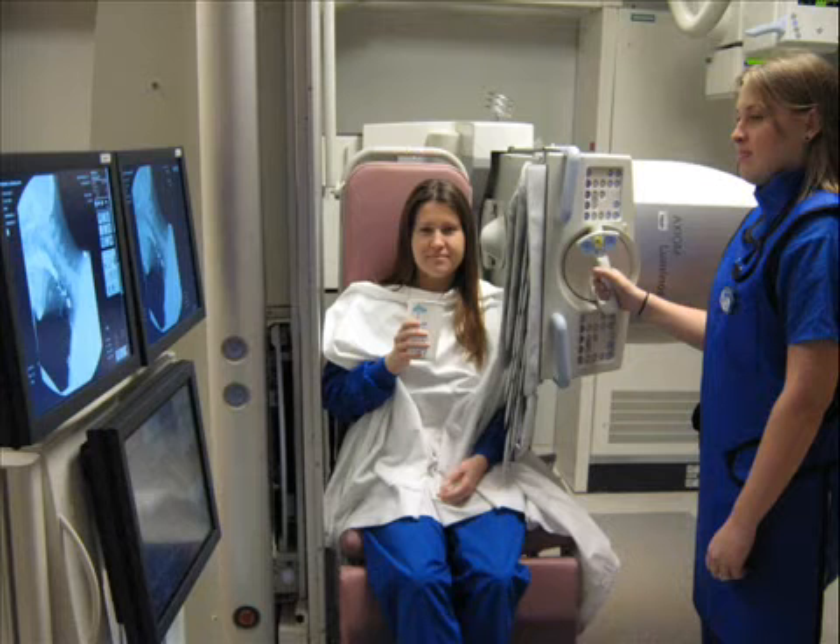A radiologic technologist will explain the exam to you ahead of time and ask if you have any questions. You will be asked to remove any metal objects such as jewelry, hair clips, or dentures.